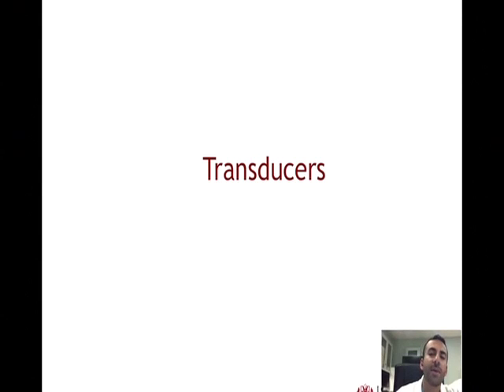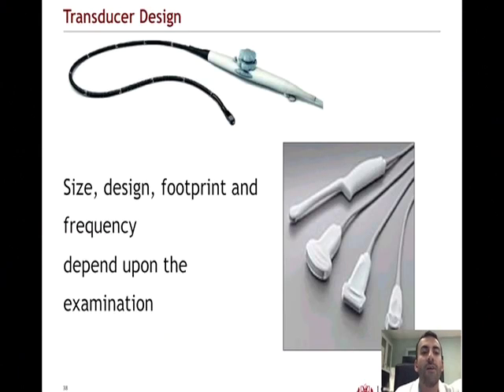So now let's talk about the fundamental transducers, or the common transducers that are used in the point-of-care ultrasound setting. First, we have to talk about essentially what the design of a transducer is. There's three basic criteria that are talked about when you're looking at a particular transducer. One is the size, another is the design, and finally the footprint.